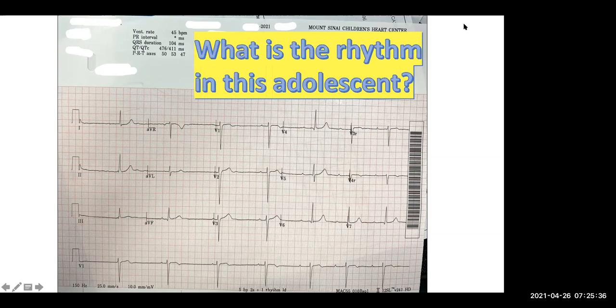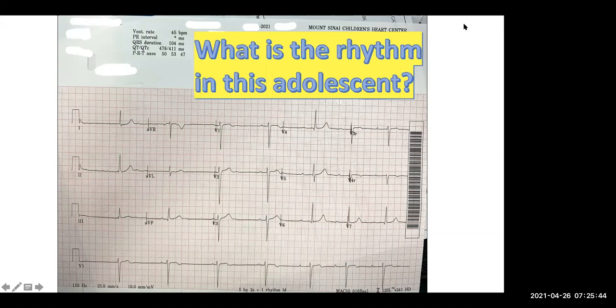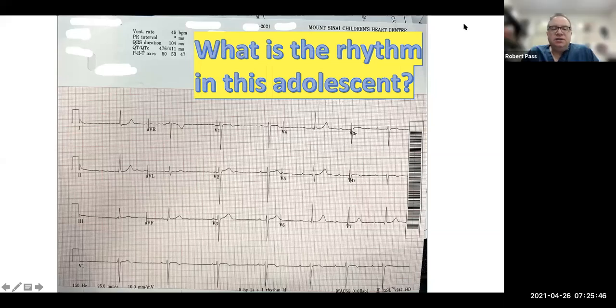No, you're thinking about the so-called wandering atrial pacemaker. Yeah, I know, but that's different. The P wave morphology. Right. So in a wandering atrial pacemaker, which is a normal finding that's sometimes used in describing Holter findings, typically late at night, patients may, when they're in sinus bradycardia, have non-sinus atrial rhythm that's almost at exactly the same rate as the sinus rate, maybe slightly faster. If you want to think of it as an ectopic atrial rhythm that's very slow, that's an old-fashioned term.